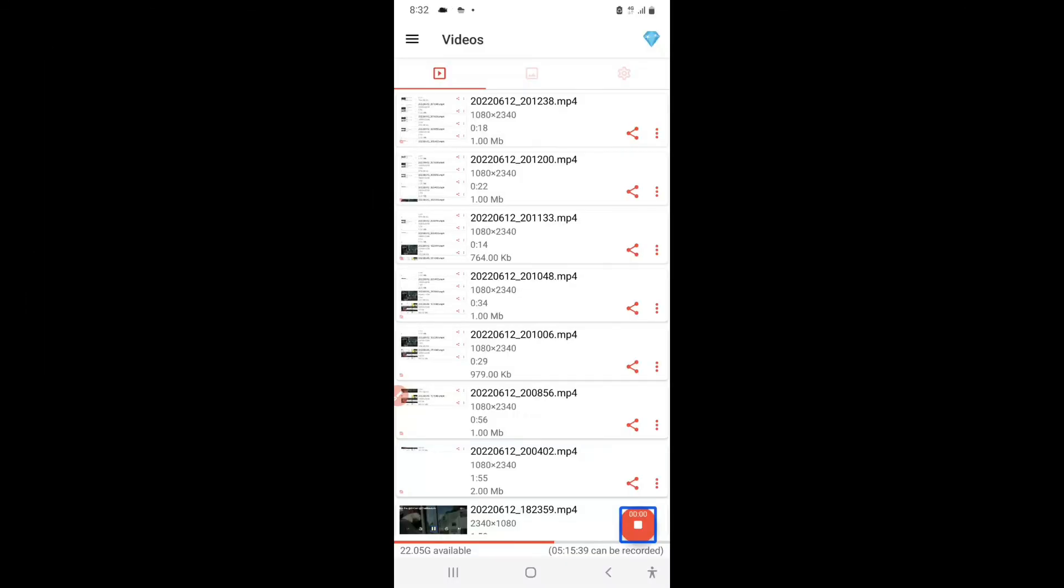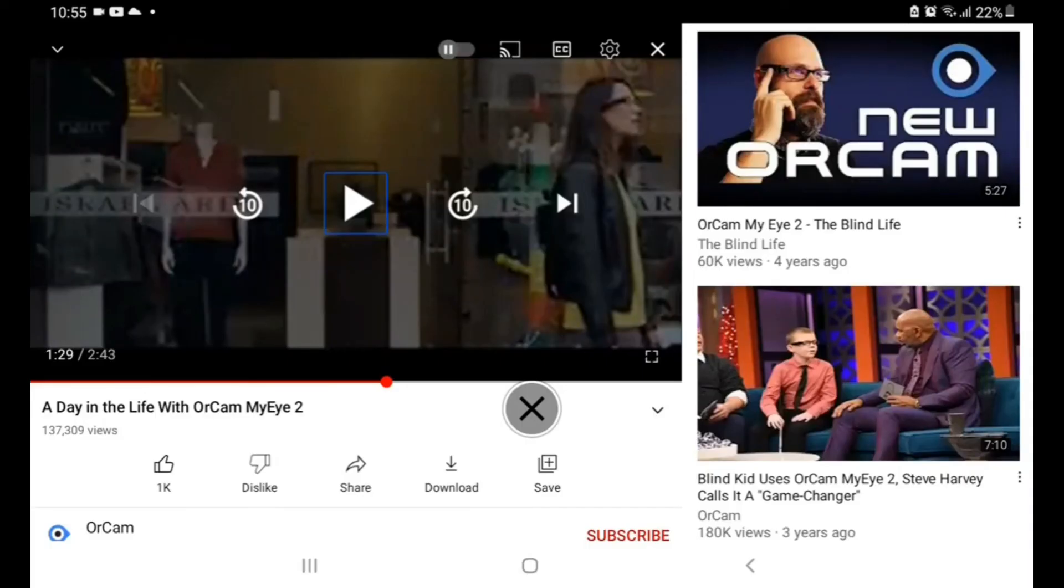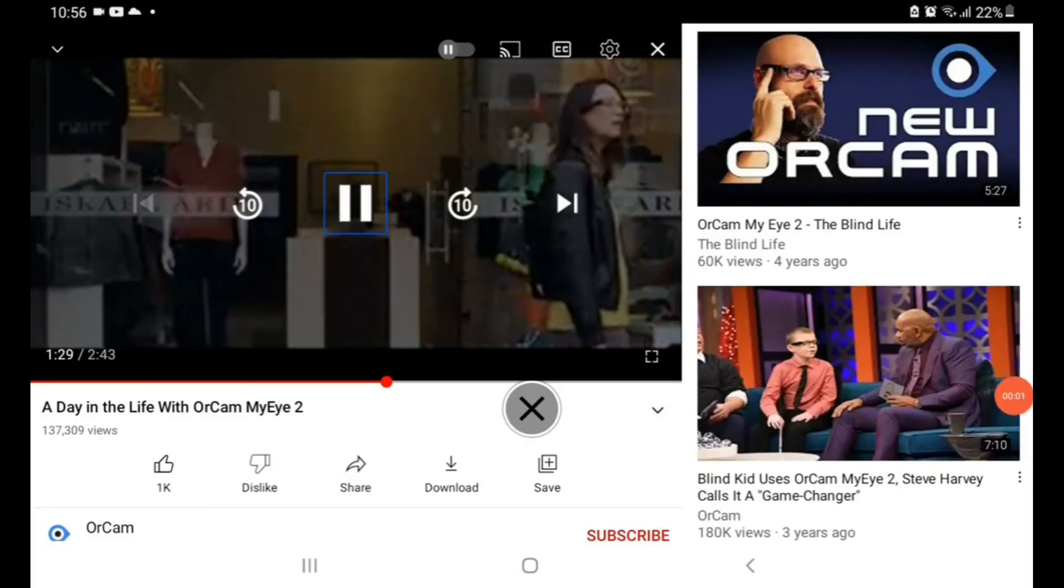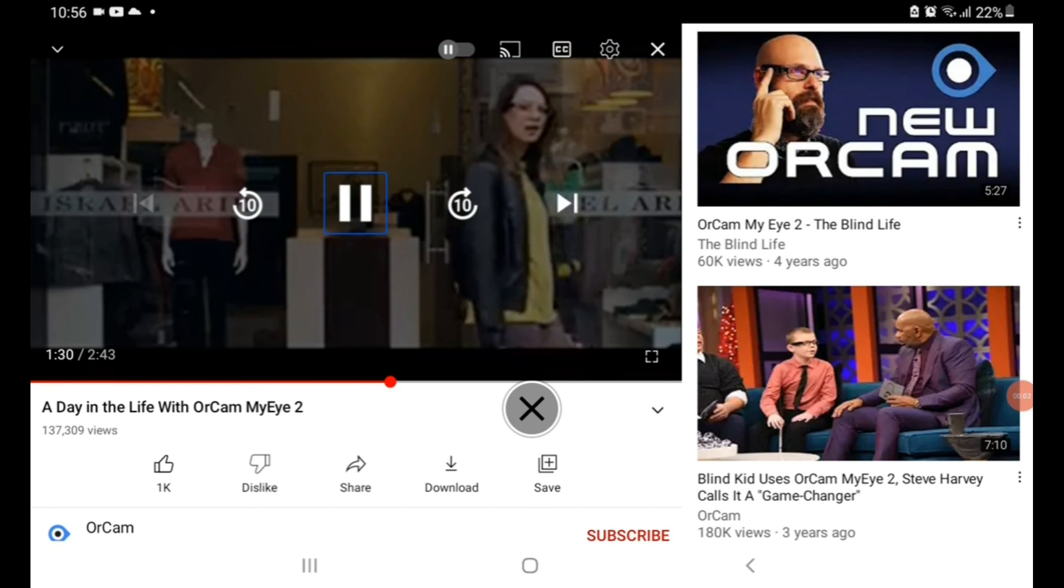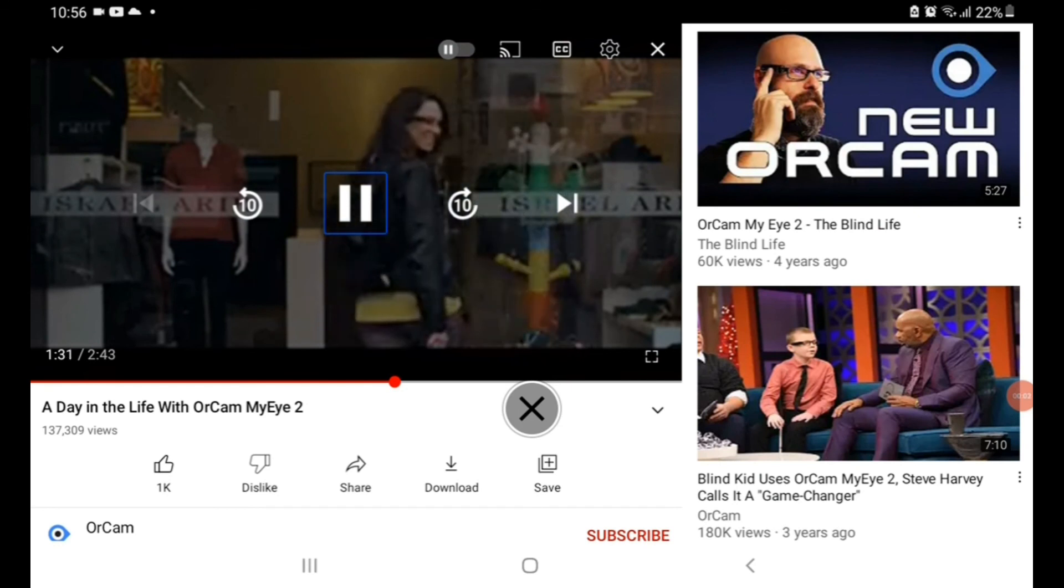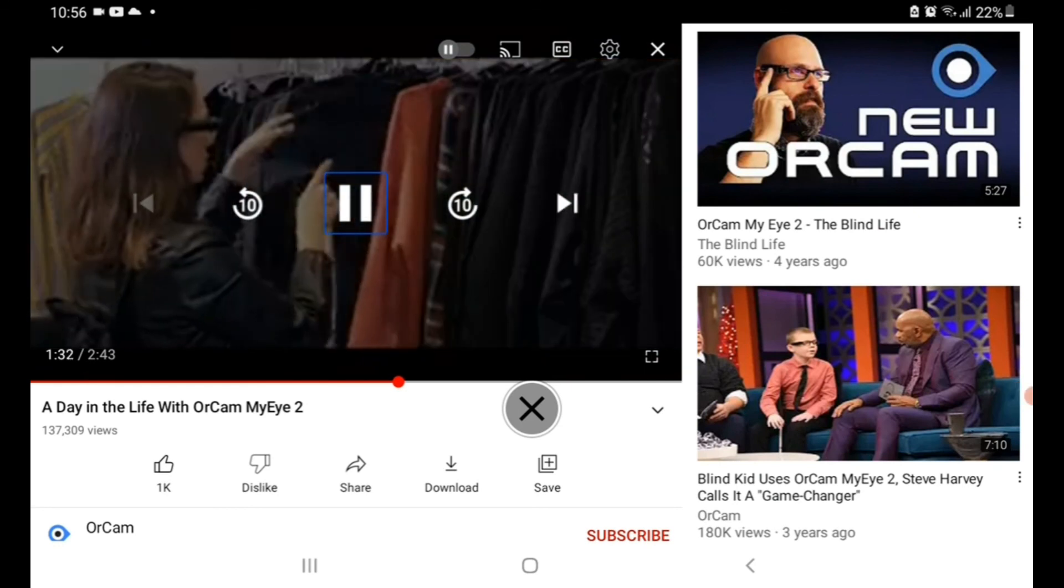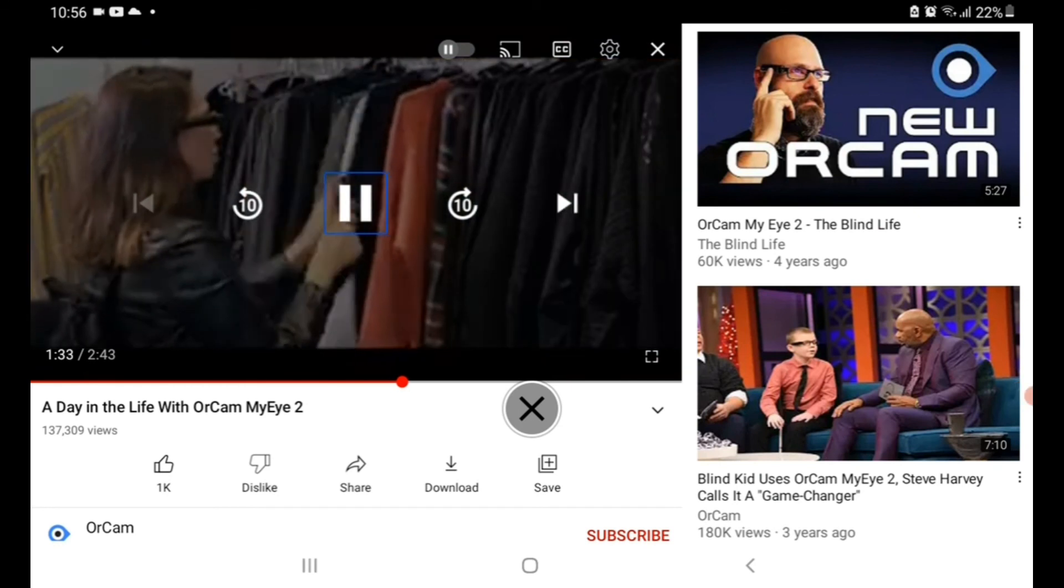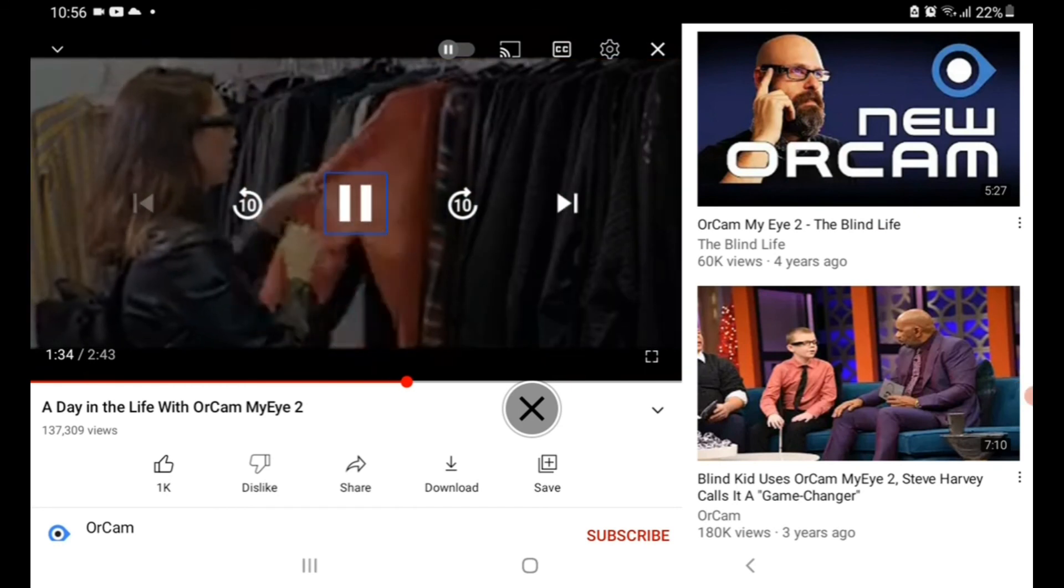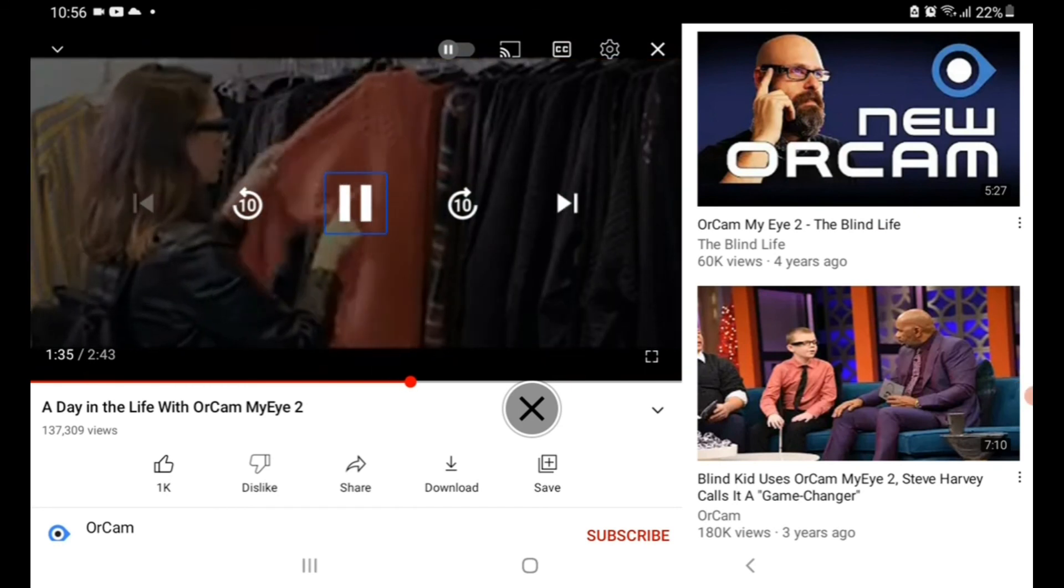It also has the feature of color identification. The OrCam MyEye. Because you deserve it. Dark blue. Pink.